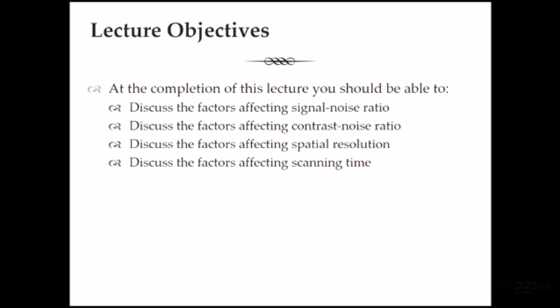Just remembering that probably the biggest enemy of MRI scanning is movement. So the longer you try and scan someone and tell them they have to stay really still, the more likely you are to get movement. And at the end of the day, that's probably going to compromise your image quality more than anything else. So image quality.